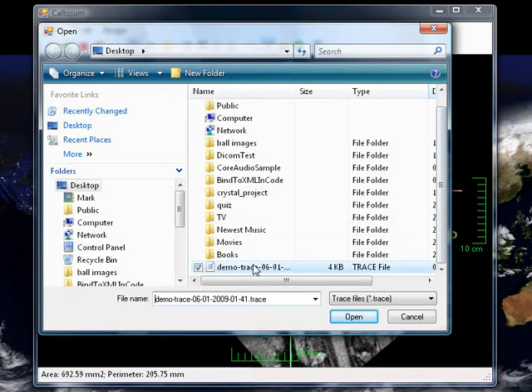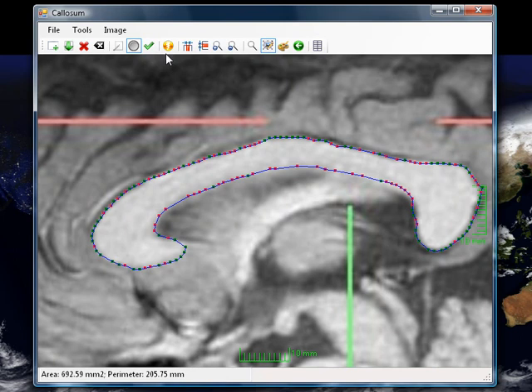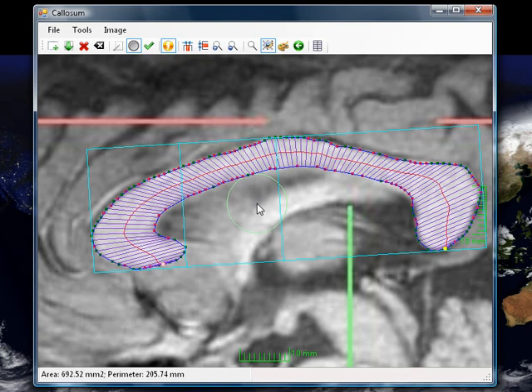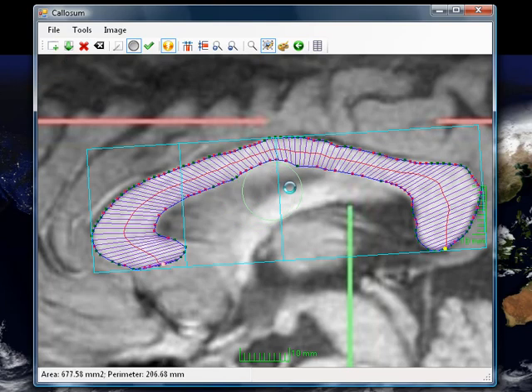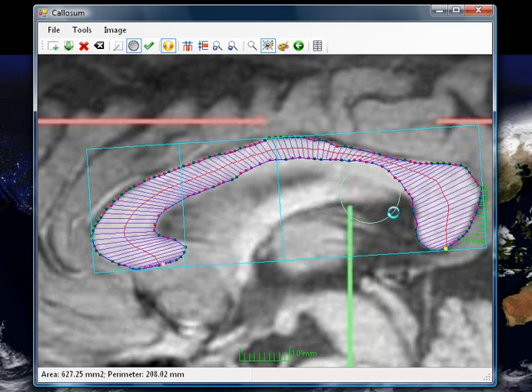One that I will demonstrate, but is perhaps of limited use, is the auto-calculate function. What this does is it runs the Denenberg algorithm every time you modify the path. So, for instance, if we nudge the path, it will perform the analysis for every single modification that we make. It's a little bit slow, so it's perhaps best if you leave this switched off, but it can be quite useful just to see what effect a modification to the path will have on the underlying widths.